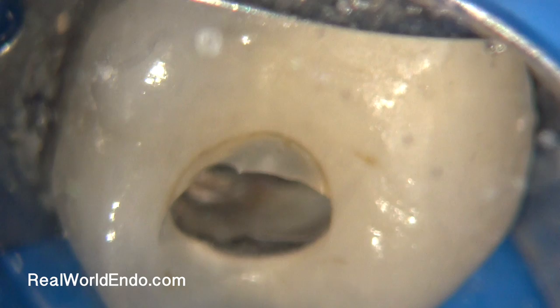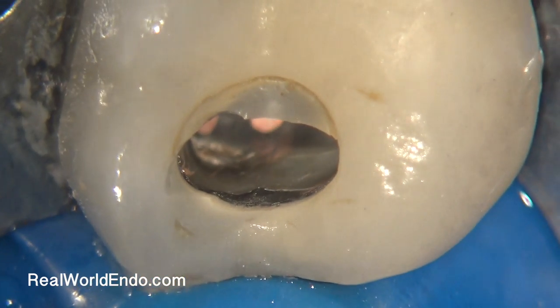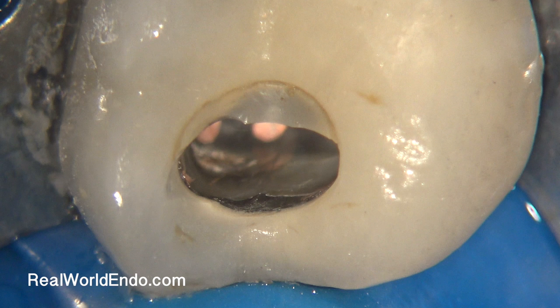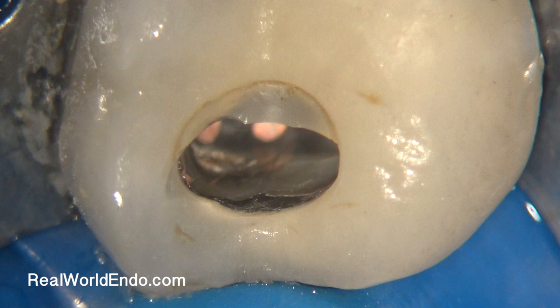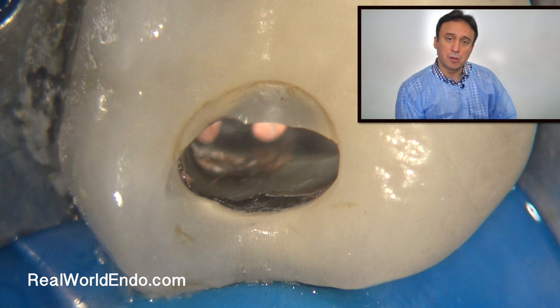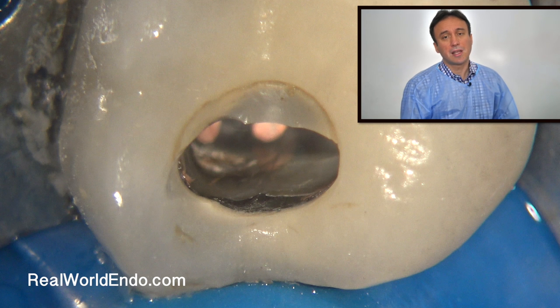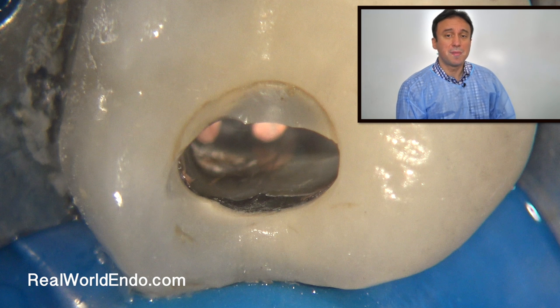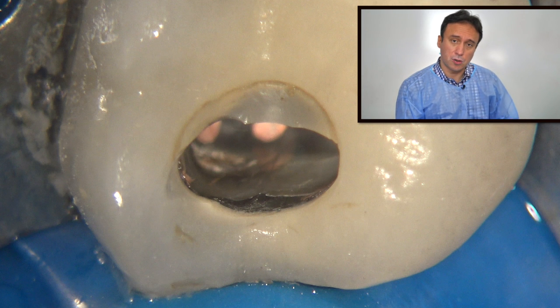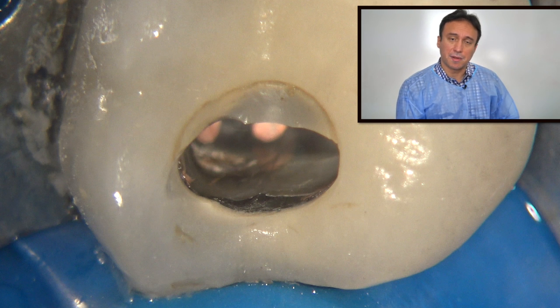This case demonstrates the importance of treatment planning. The crack line was very small, and a CBCT wouldn't have shown it anyway. In some cases, a missed MB2 can create a similar lateral or sulcular sinus tract that mimics this kind of look, so we need to visually be able to validate these types of cases.